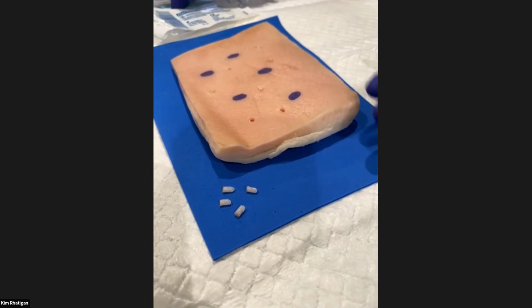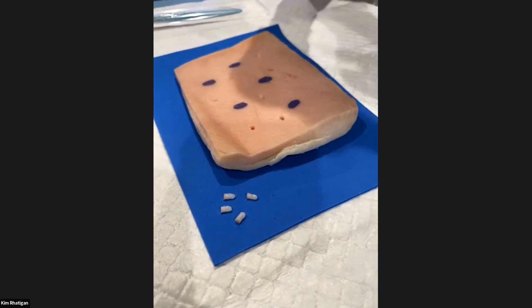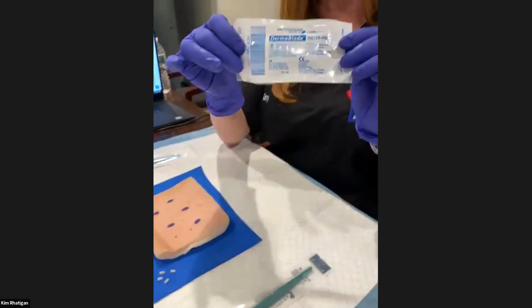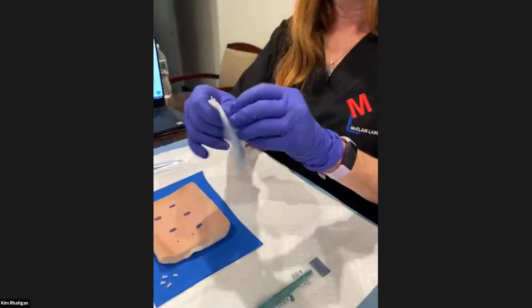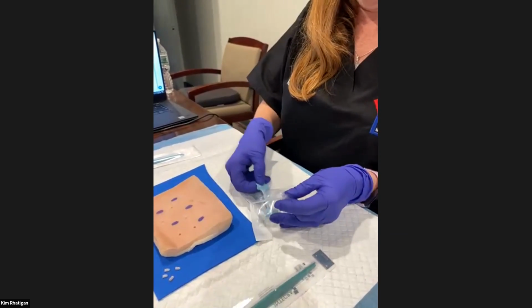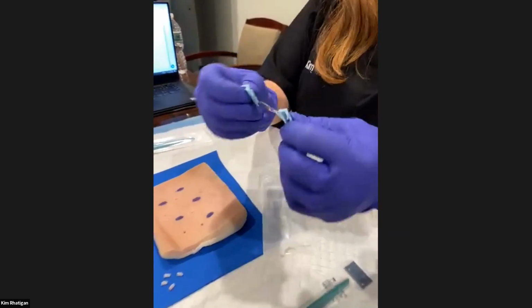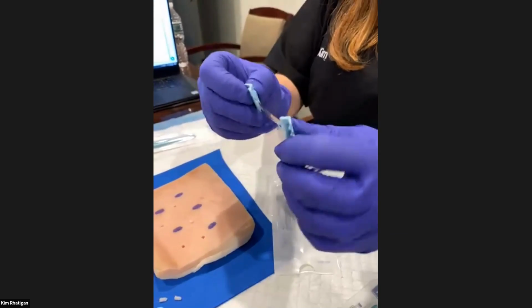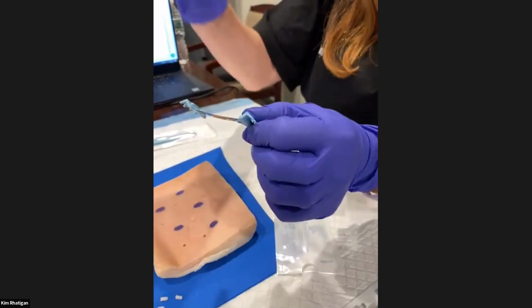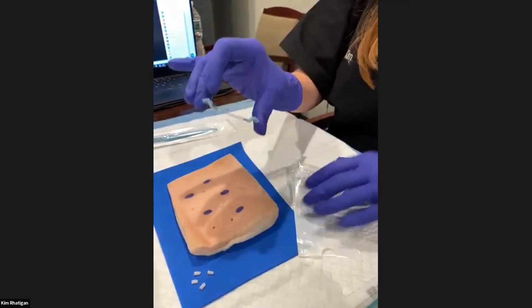Okay, let's work on another tool. We're going to go on to the shave biopsies. This is your dermablade tool. I'm going to open up the dermablade. Now this is a very sharp, bouncy tool. You can see it's very bendable. So be very careful, because I've seen these pop out of people's fingers. I've seen them pop backwards. So be very, very careful.